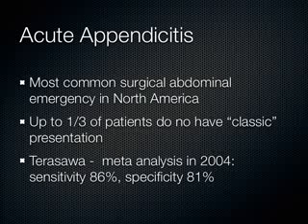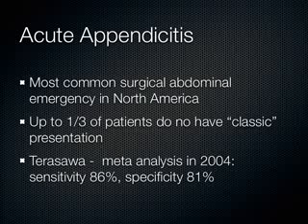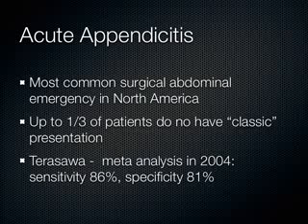Now, CT clearly has the best characteristics here, but doing a CT scan is about 500 chest x-rays worth of radiation. And when you're young in life, your tissue is more radiosensitive, and you have a longer time in which to absorb radiation throughout your life, and radiation exposure puts you at risk for cancer as a cumulative effect, so we try to avoid unnecessary CT use, especially in patients less than 35 years old. And certainly when I have a kid in my ER, 10, 12, 14 years old, I really try to avoid getting a CAT scan on them, though sometimes I have to get it because the benefit outweighs the risk.